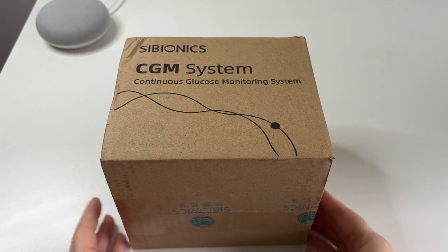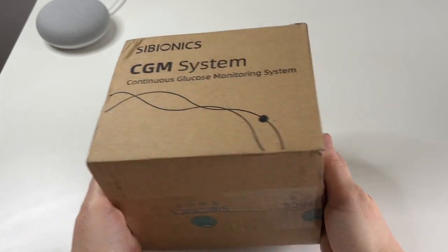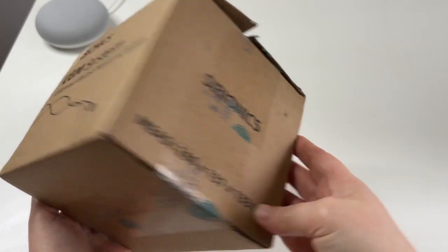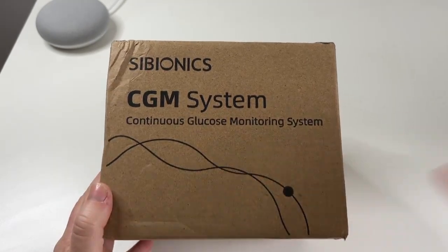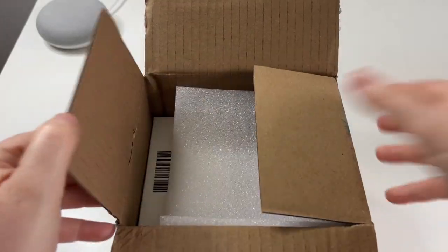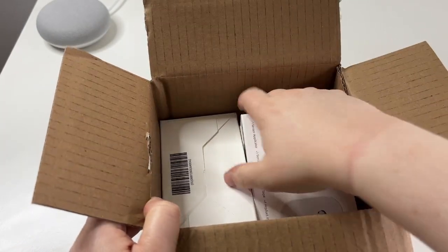So I got this little cardboard box. I don't know how many samples are in here, although they gifted me it. It says Sibionics all over and this did come from Hong Kong. I'm thinking there'll just be one sensor in here for the sample. Oh my god, I think there's actually two — this is great.